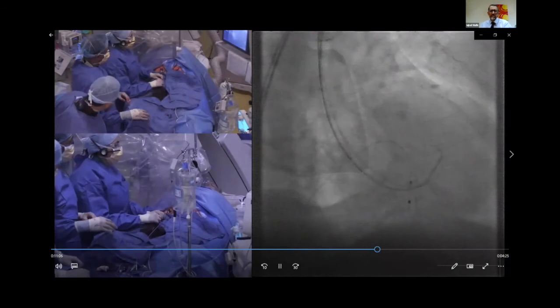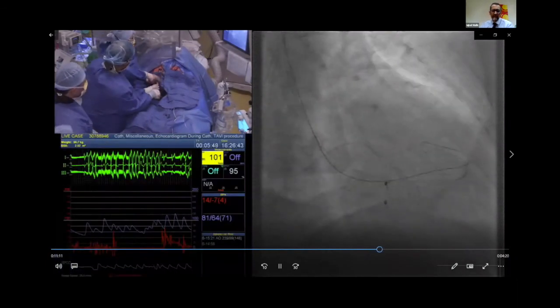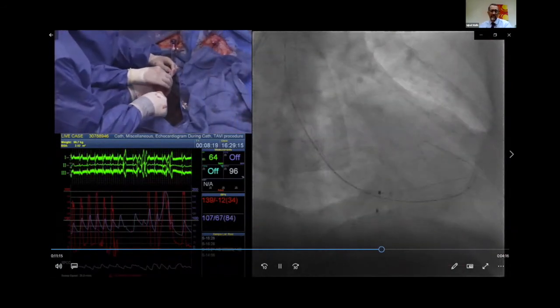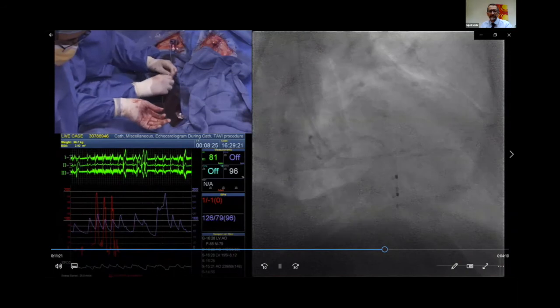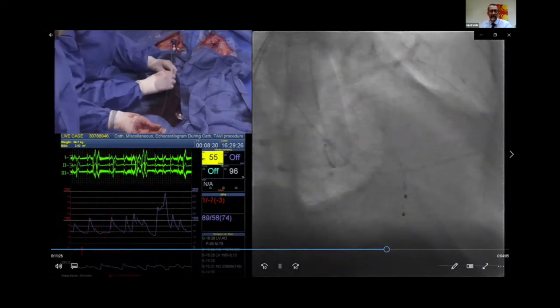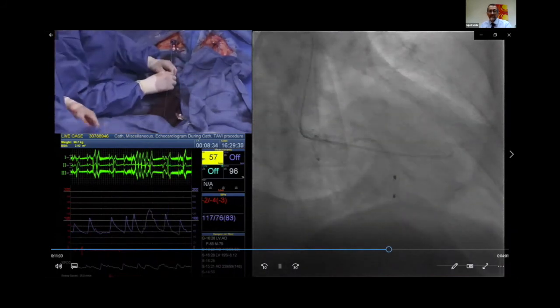In those days, especially with that patient old, we're still using a formal temporary pacing wire. And because of the new access route, I think we did that just to have an extra layer of safety. If we were doing it again now, I wouldn't bother with that. I'd use pacing via the Safari. But this is quite a horizontal aorta. There was nothing easy about this guy. Forget just the access. There was nothing easy about it.